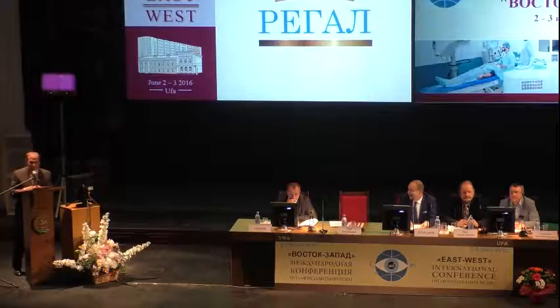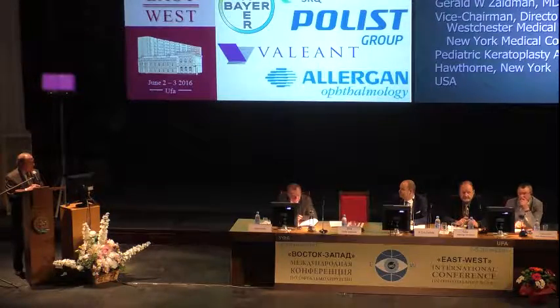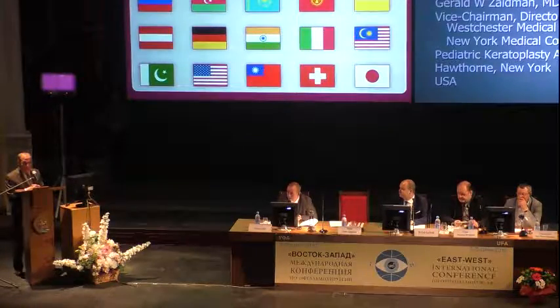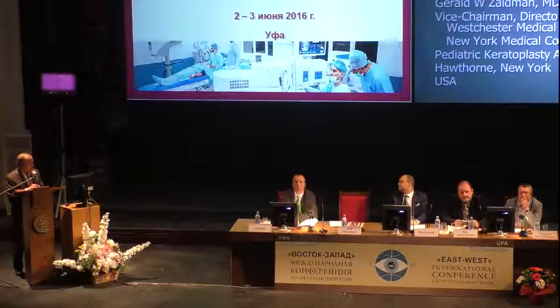The second's a good question. The lens is very stable. For those of us old enough to remember the days of old extracaps, the lens stays in the eye the same way a 3-piece lens implant that was used during the era of extracaps will. There's no instability. If you get it into the bag, then it remains perfectly stable. I've never tried putting it into the sulcus, and the manufacturer does not suggest that you put it in the sulcus. I understand some people have done that. I can't comment on the results. But if you get the lens in the bag, it's perfectly stable.